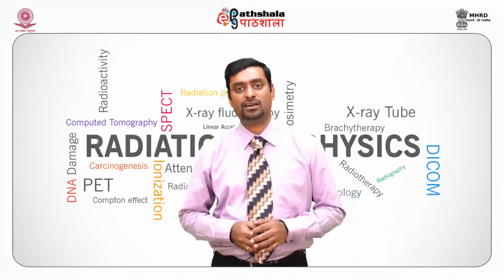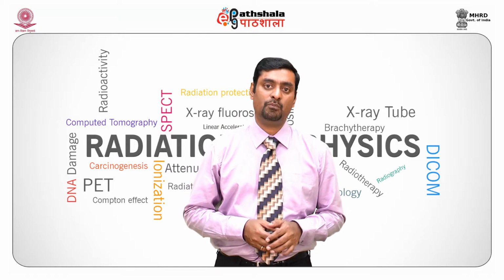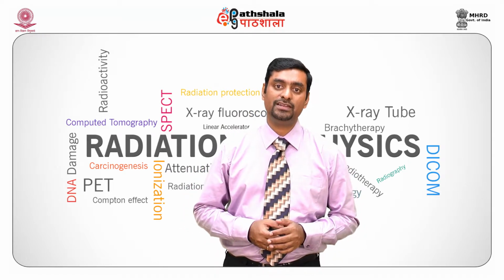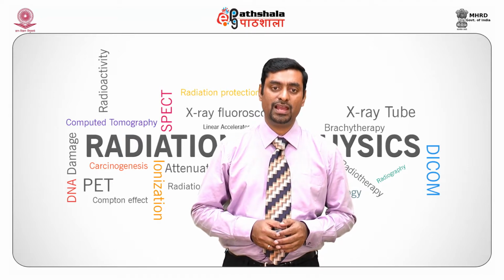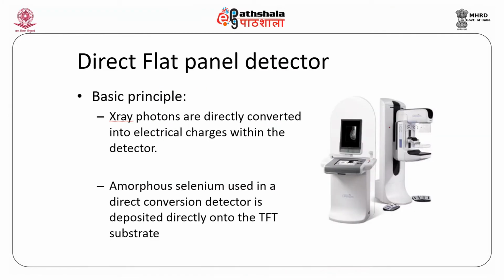This kind of detector is more commonly used these days, but it is more expensive compared to the indirect flat panel detectors. In this principle, we have X-ray photons that are directly converted into electric charges within the detector. What is the detector that is used? Amorphous selenium, which is used as a direct conversion detector and is deposited directly on the thin film transistor substrate.